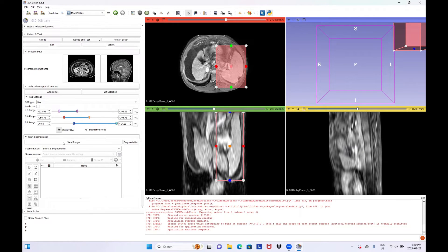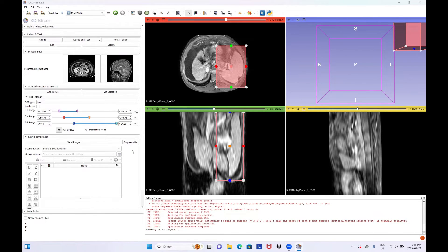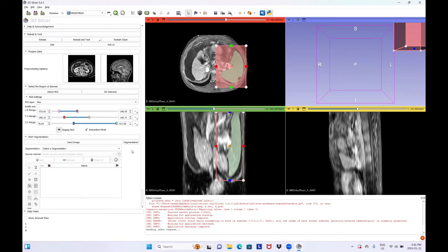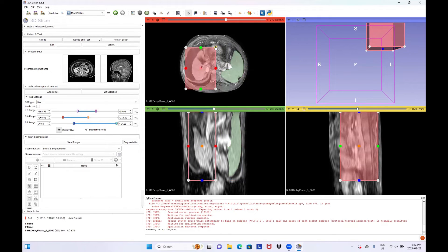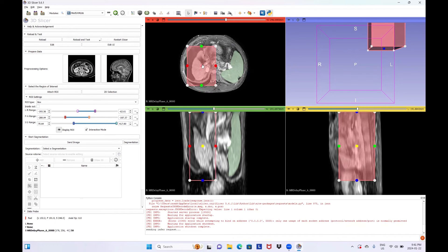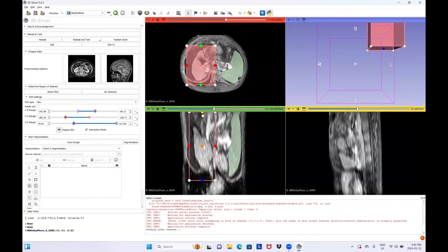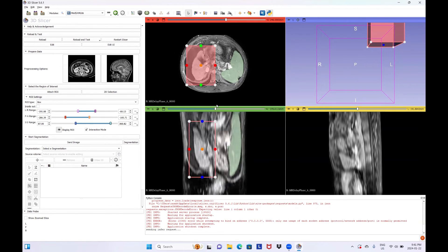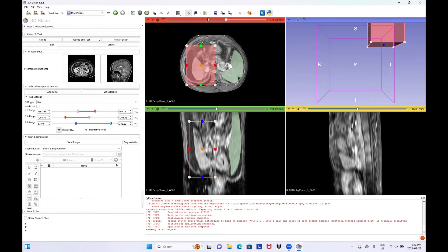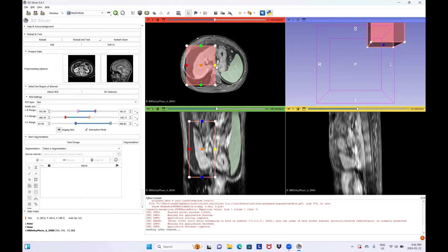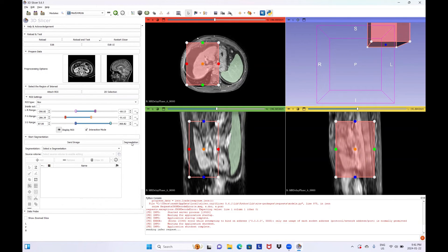After completion of this step, click on Segmentation button to get the segmentation results. You can replace your ROI or delete and reattach it as many times as you need and repeat segmentation without sending image again.